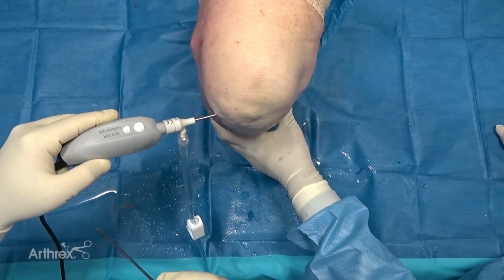So we're back on the medial side of the knee now. You can see a small meniscus tear back here. One of the advantages, this is a tight knee, obviously an arthritic knee. One of the great advantages of the nanoscope is it can slide into a tight compartment, and we're working percutaneously through this medial compartment. We're going to percutaneously place our Nanosaber device, and again, we're going to do a partial meniscectomy here with the Nanosaber.